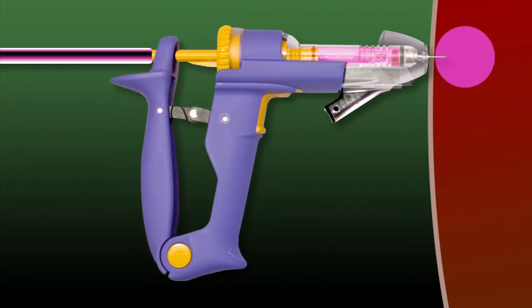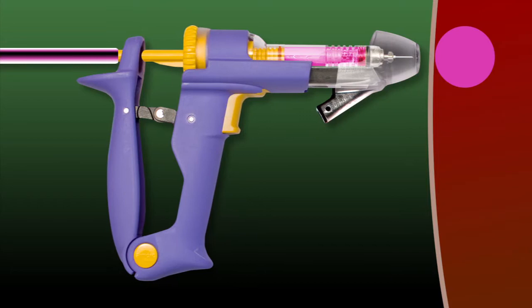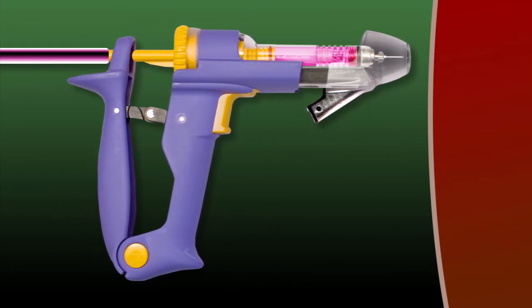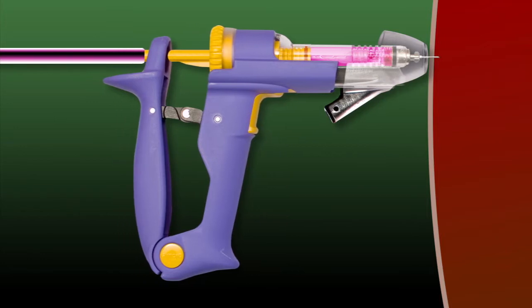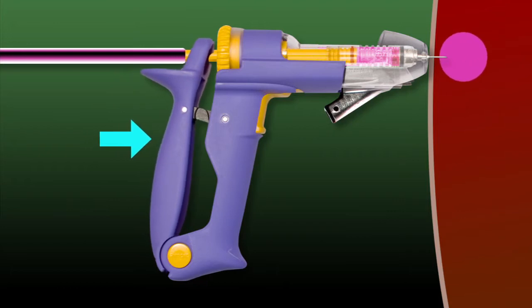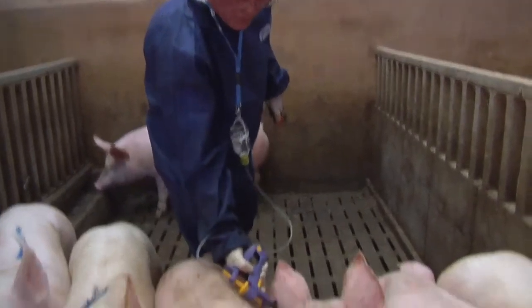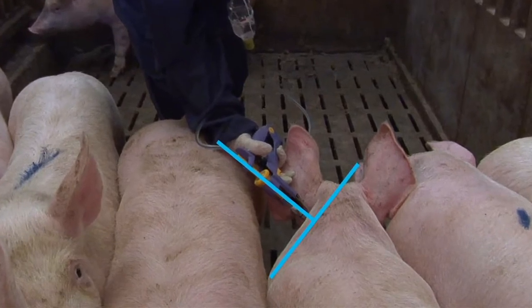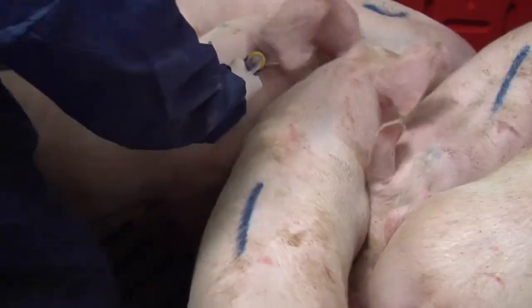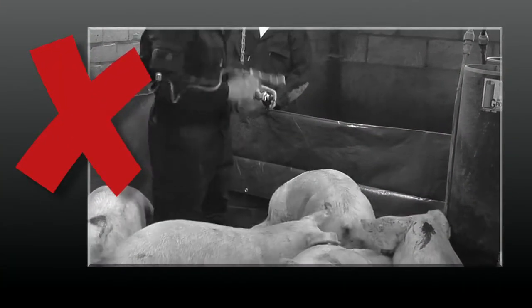The injection should not be delivered by squeezing the trigger, but by pushing the injector against the pig once it is over the correct injection site. The correct technique causes much less fatigue and ensures that the injection is given in the right position, and that the needle penetrates the skin sufficiently. As far as possible, the injector should be held perpendicular to the skin to allow the needle to penetrate to the correct depth. It is important to move the injector around to get the correct injection site, rather than just punching the device straight into the pig.